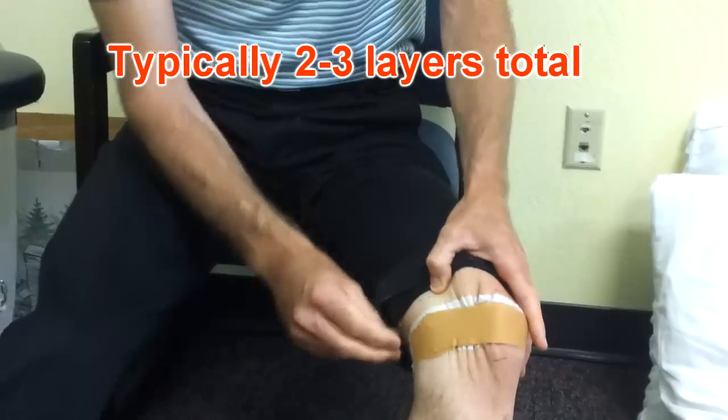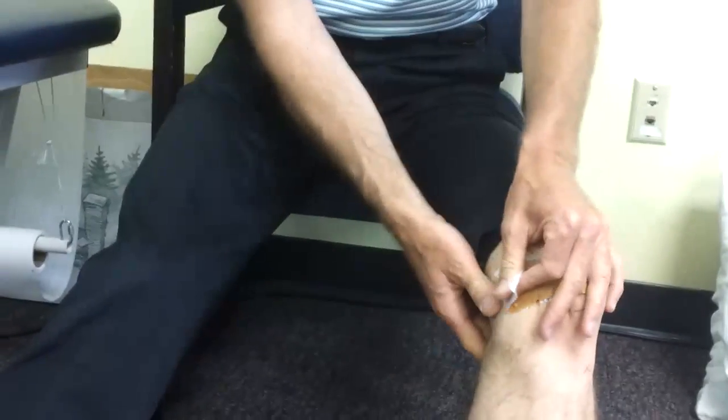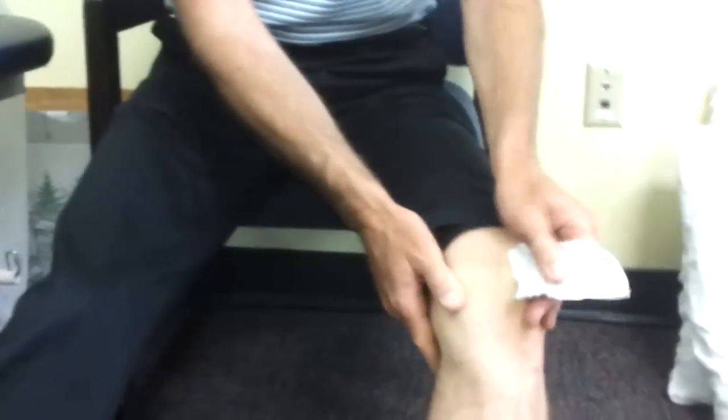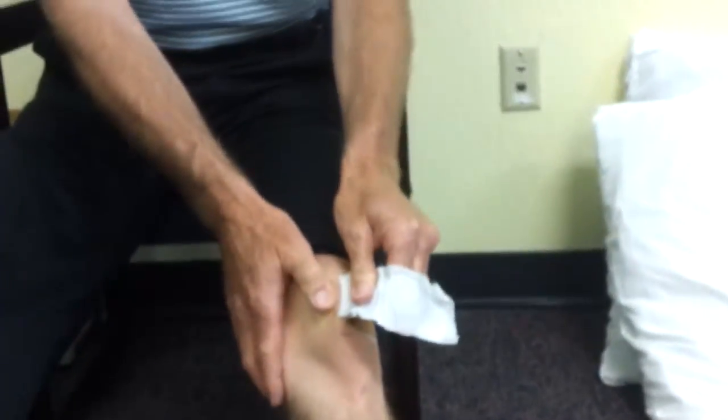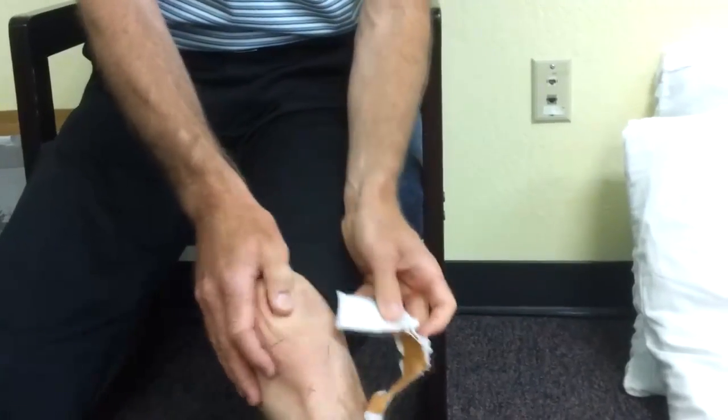To get the tape off — there's a lot of tension on this tape so the skin will start to break down. You want to respect your skin and let it have rest from the tape. Only use the tape if you feel it's benefiting you. The tape is only a short-term solution, not a long-term one — just while you're in therapy. Some people use it just for a high-level activity to get through it, then take it off. There's no need to wear it unless you're doing something strenuous or painful.